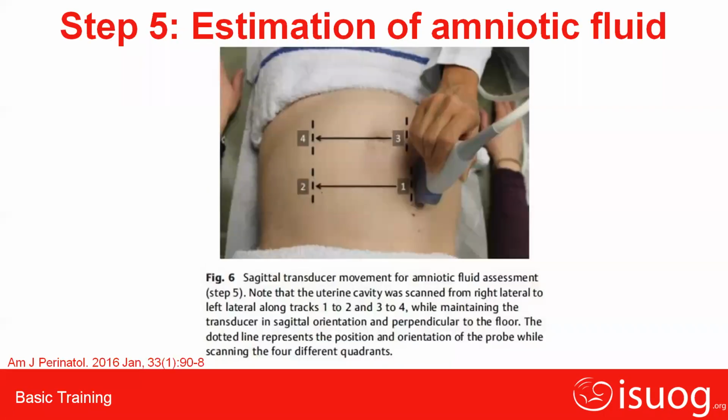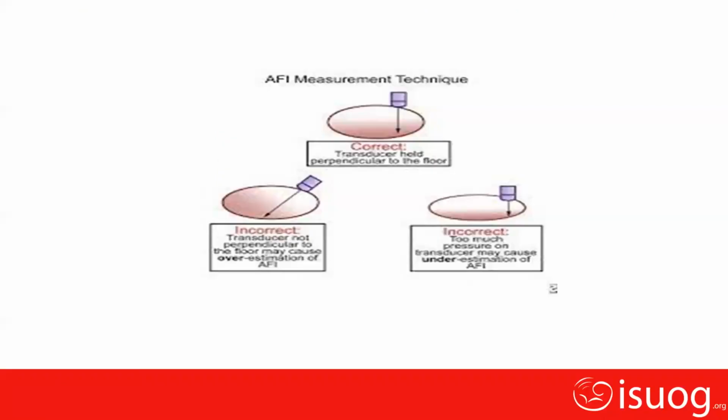Thank you, madam. So this is the correct positioning of the probe, and this is the incorrect positioning of the probe.